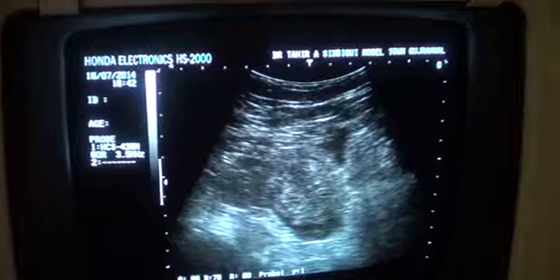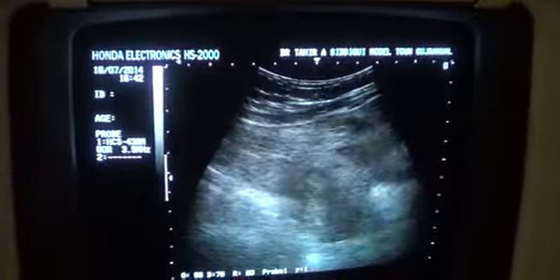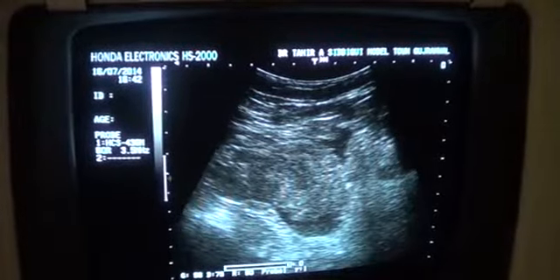So this is our case of the day, which pertains to two pathologies. One, the chronic liver parenchymal changes with ascites. Second, bilateral renal parenchymal changes, grade 1.